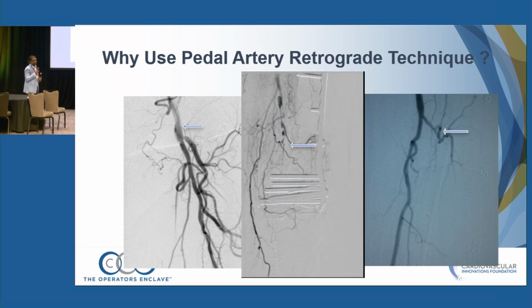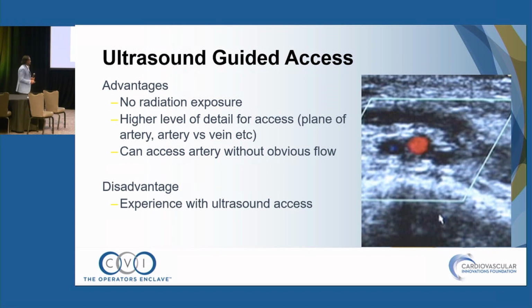And this would be another one, especially the popliteal artery. If you see this, we just have a catheter up top and then we immediately go retrograde, because there's no way I'm going to get antegrade access because of those geniculate collaterals. So it's just best to go retrograde in these situations.